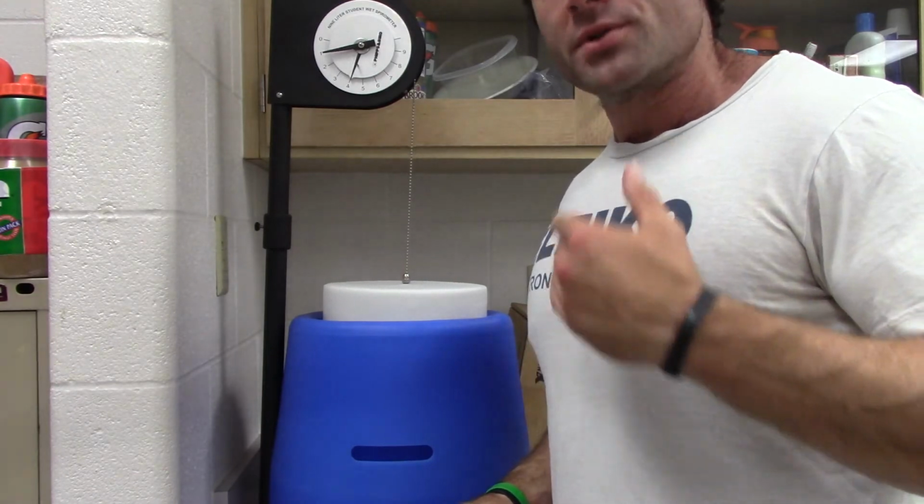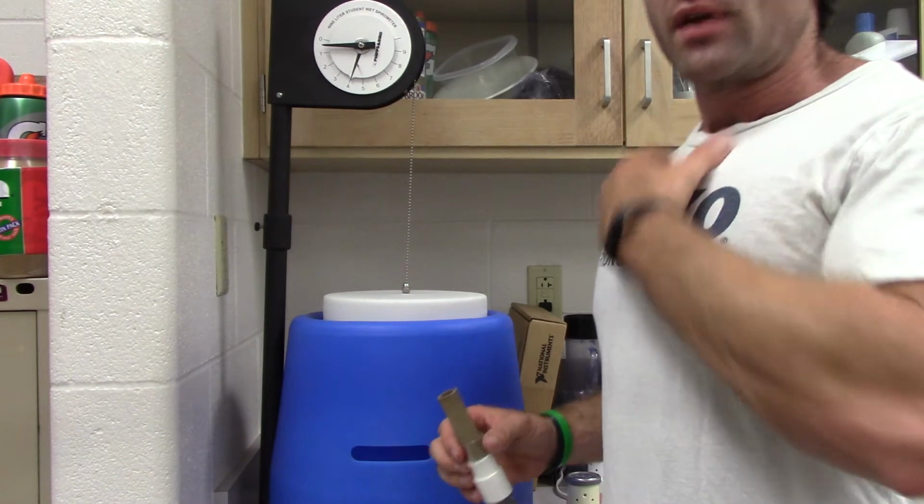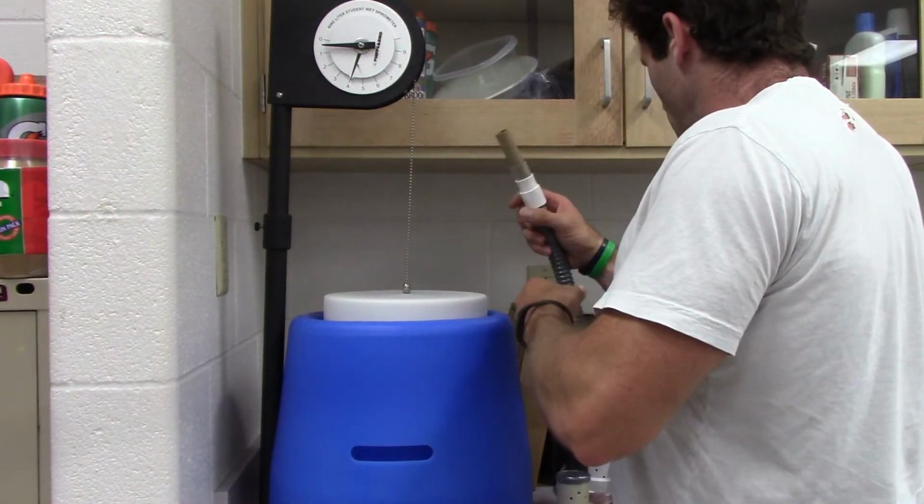And that's going to be my forced vital capacity, the greatest amount of air that I can take in and take out. Now, I still have the anatomical dead space, which is going to occupy a little bit, but that does give me information for my total lung volume.